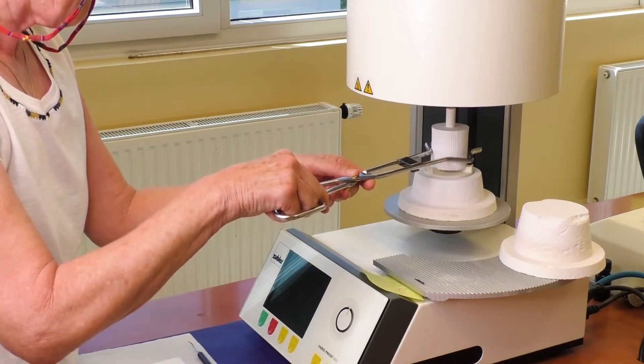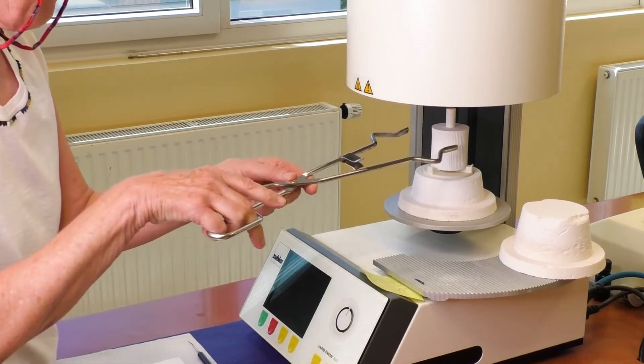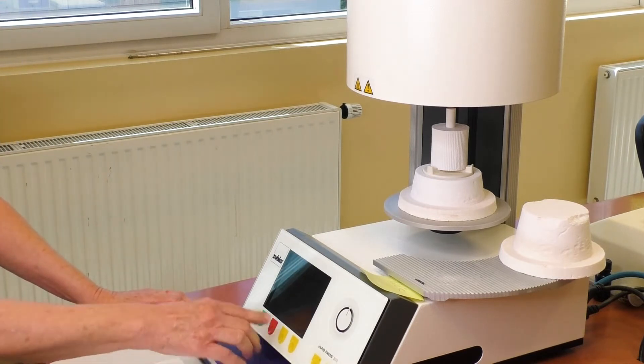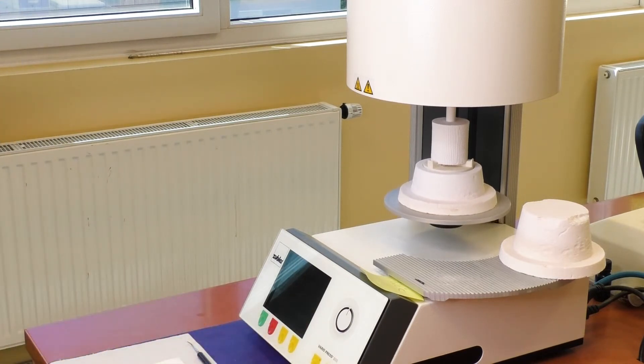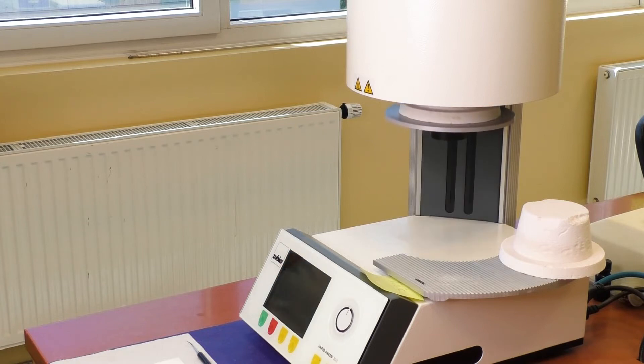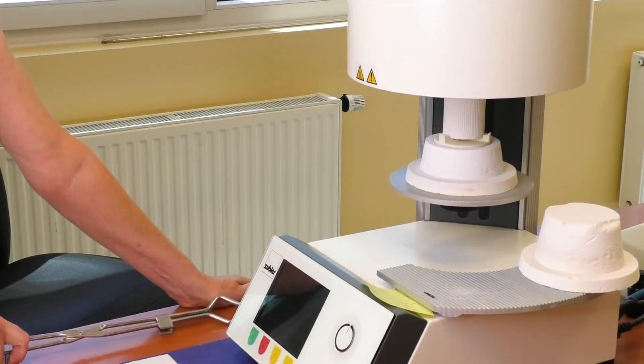If the pressing temperature is too low, the object is not completely pressed. If the pressing temperature is too high, you get a strong reaction layer. Raise or lower the temperature in steps of 5 degrees Celsius.